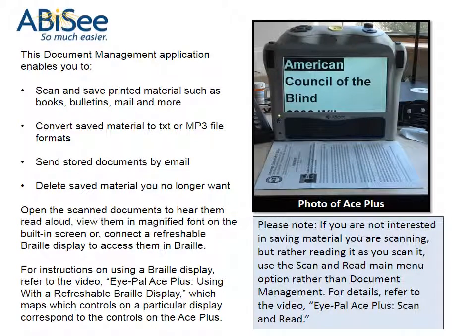This document management application enables you to scan and save printed material such as books, bulletins, mail and more; convert saved material to TXT or MP3 file formats; send stored documents by email; delete saved material you no longer want; open the scanned documents to hear them read aloud, view them in magnified font on the built-in screen, or connect a refreshable braille display to access them in braille.